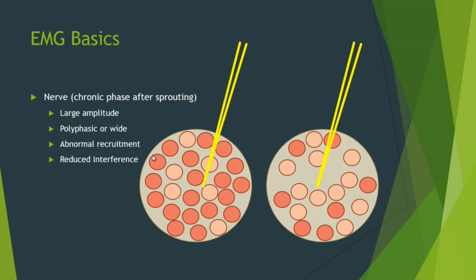So if this is the recording field over here, and now I've highlighted muscle fibrils which have been innervated by different motor units. If we have a neuropathic process that's occurred, we've wiped out a whole bunch of different muscle fibrils over here, and terminal sprouting has occurred, and then some of the motor fibrils will now be converted, as it were, and are now sort of sucked into the remaining motor unit.